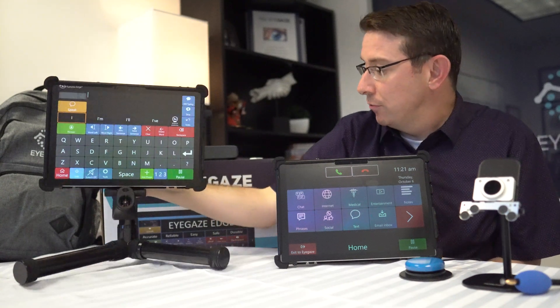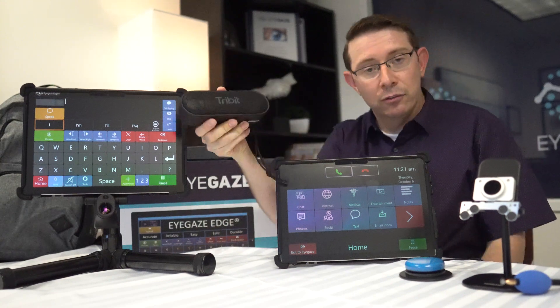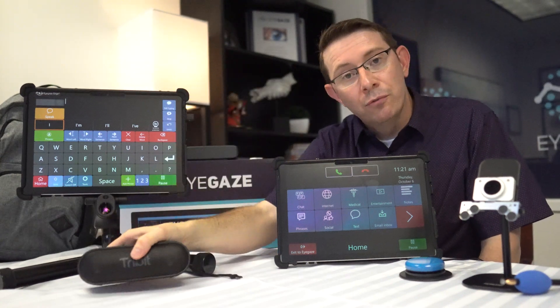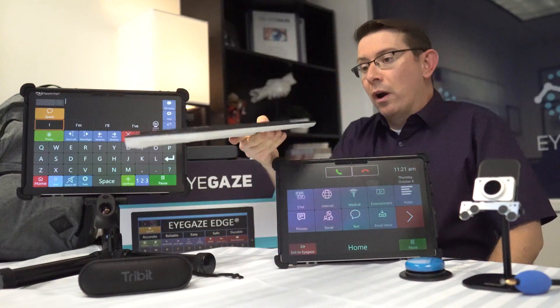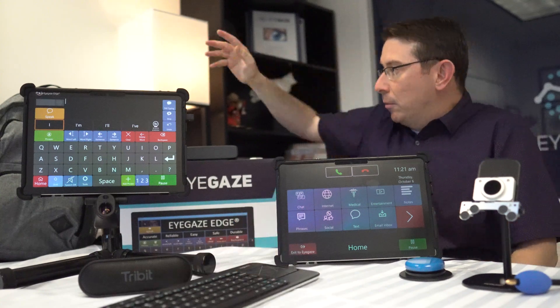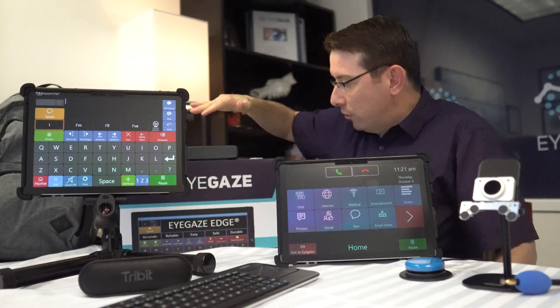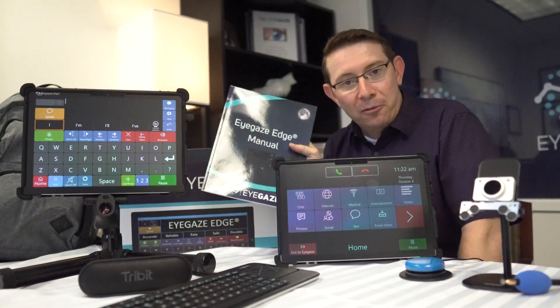Every iGaze Edge device comes with a few standard accessories, including this external Bluetooth speaker for extra volume and listening to music. It also comes with this wireless keyboard and mouse trackpad, a carrying backpack, and this box here.